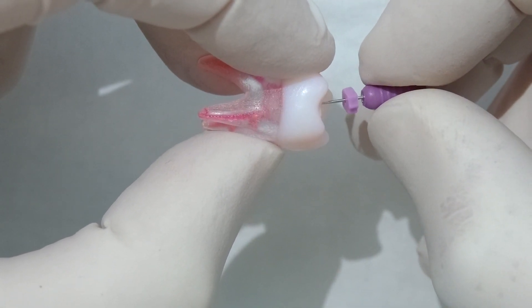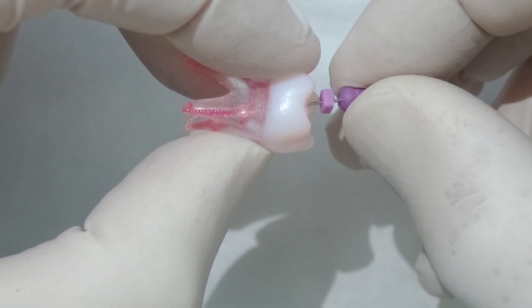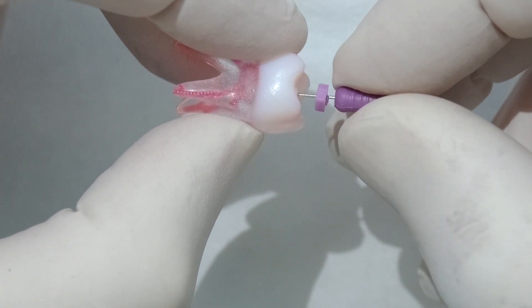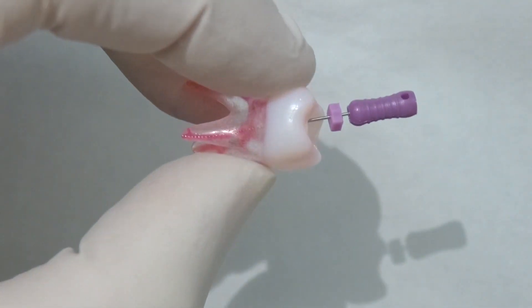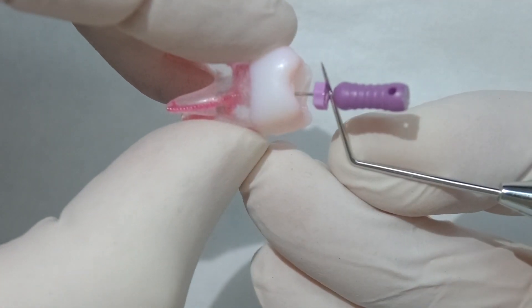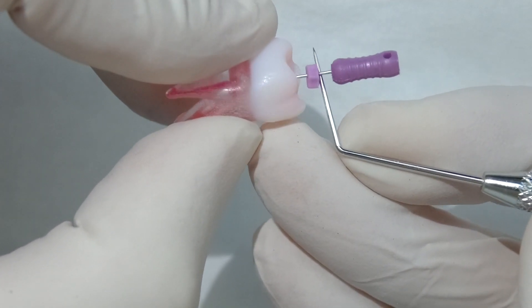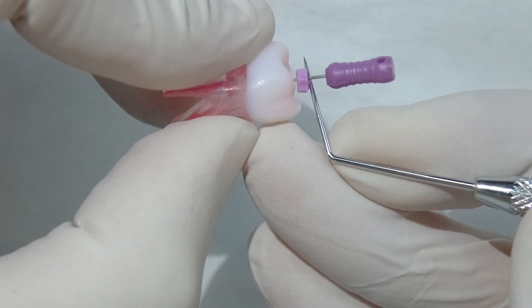We progress that along as we would normally, just really gentle little small watch-wind movements. The idea with the patient is you want to get this down to the point at which your estimated working length you've gauged from your pre-op x-ray. Once we get to that stage, we attach our apex locator, take it to the zero point.